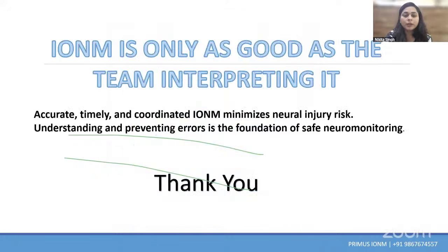So, to summarize, preventing IONM errors depends on three factors. One is stable physiology, second is accurate monitoring, and the third is seamless teamwork. So, thank you so much.